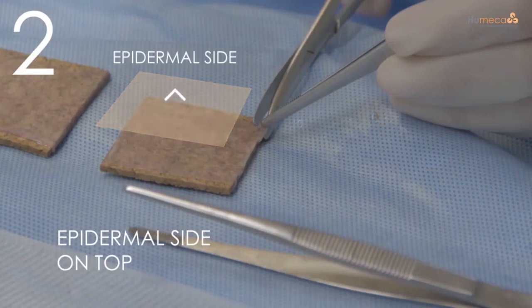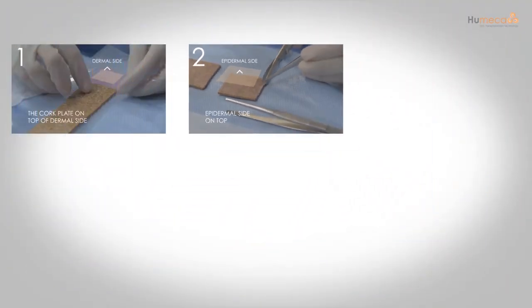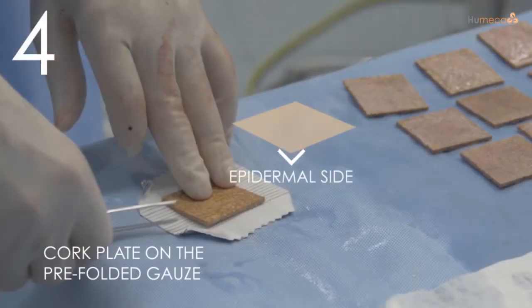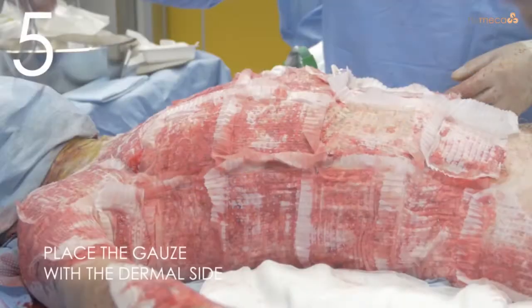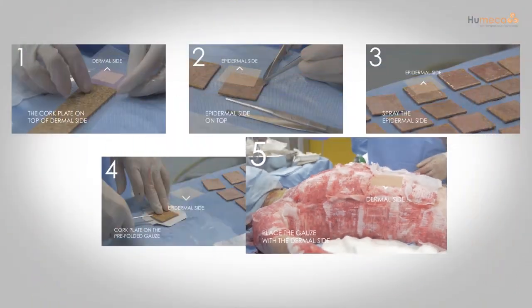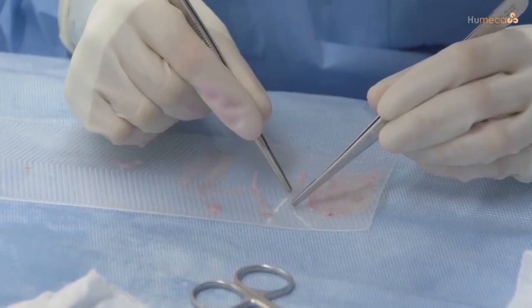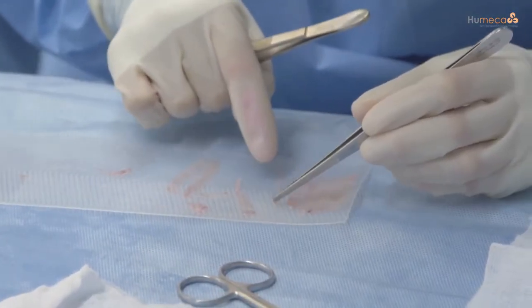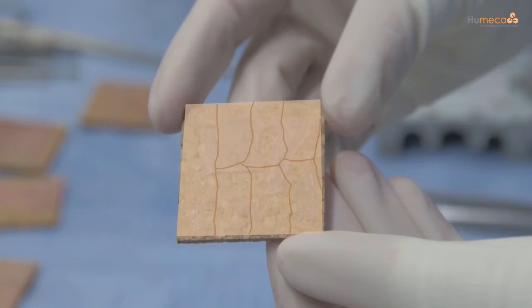Place the cork plate on the dermal side of the skin, then turn the cork plate over with the epidermal side on top. After cutting it twice, spray the epidermal side with glue, then place the cork plate on the pre-folded gauze, taking care that it is lined up exactly on the central square of the gauze. After removing the cork plate and expansion, place the gauze with the dermal side of the skin on the wound bed. Left over pieces of skin can also be used — no skin is wasted, which is especially advantageous in cases of extensive burns where donor sites are scarce.